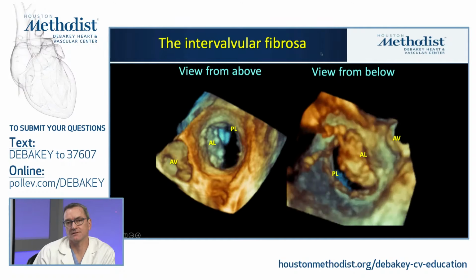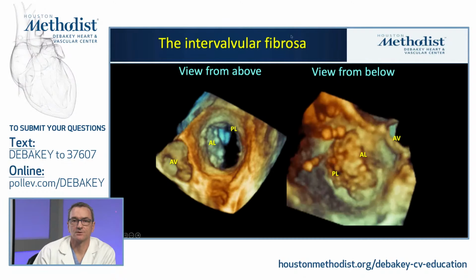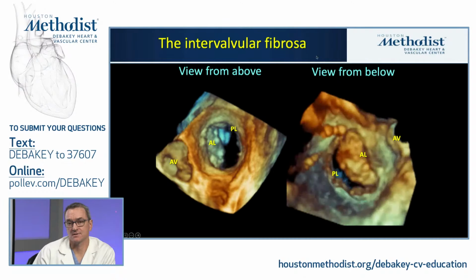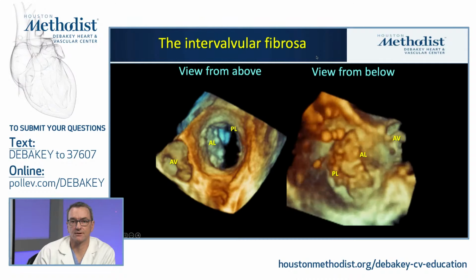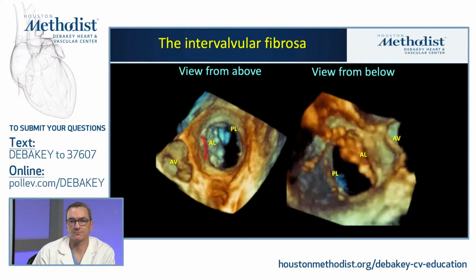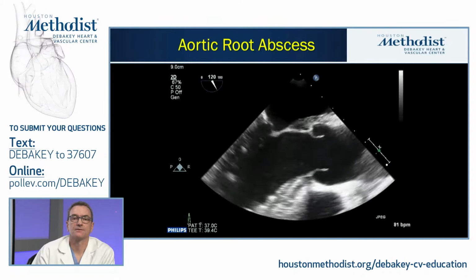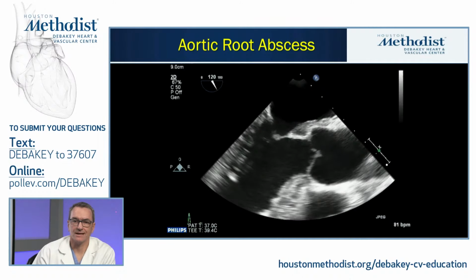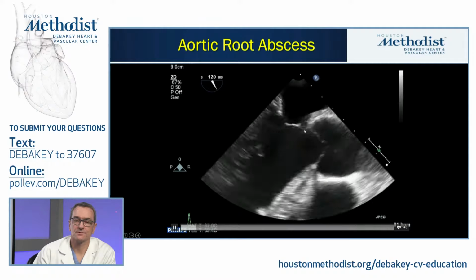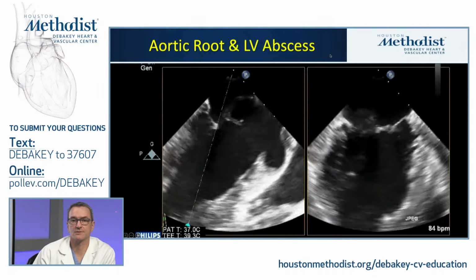So particularly invasive organisms like Staph aureus will take advantage of this proximity. So we have to have a very high index of suspicion for associated lesions with endocarditis. And chances are, if you think it's 2 separate lesions, it probably isn't, or one led to the creation of the other. So this is a different example of an aortic root abscess. This is a sort of very clear thickening here. This one is fairly homogeneous in its sort of appearance, but often it is not so homogeneous.